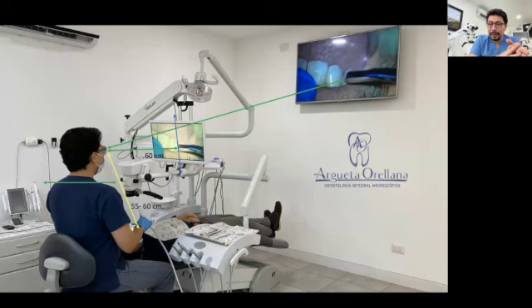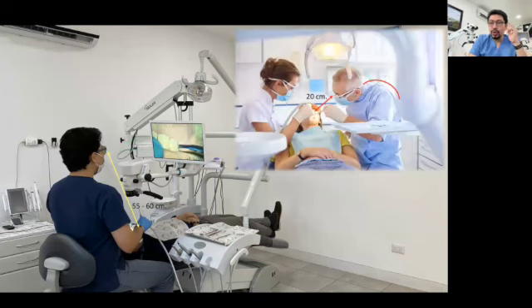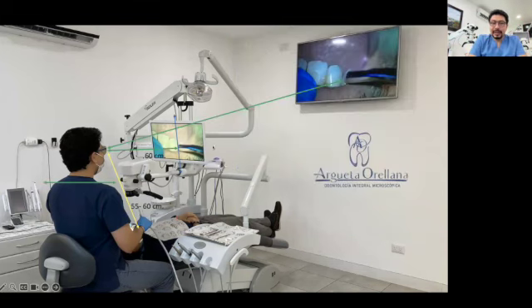Another important factor: your vision should go straight to the center of the screen. Your vision should hit the center of the screen at a 90 degree angle, for having the sharpest 3D images. Of course, if you are not looking at the screen at 90 degrees to the center, you're still seeing in 3D.